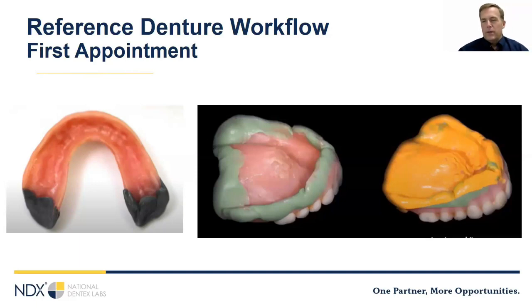For the mandible, you want the patient to pucker, show their Duchenne smile, then stick their tongue out and move it from side to side before closing and swallowing. Once the heavy body material is set, you'll apply a low viscosity material to the internal surface of the denture and go through all the border molding steps again. This is best to do with any impression situation.